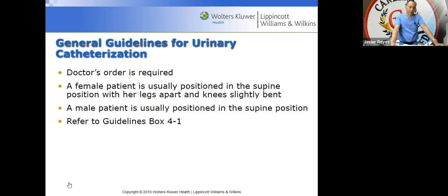The problem was that she can't really move her legs, and her legs weigh like 50 pounds each, right? I asked her to bend her legs, and she's lying on a bed where she's sunken in. So her bottom was sunken in, but her legs were up. It was very difficult, and of course, I could not insert the catheter. If I did insert it, I probably didn't get it in the right place, because it didn't get urine output. In 20 years, I've never really felt inserting catheters was very easy, but this lady really gave me a hard time. But, it comes to practice.